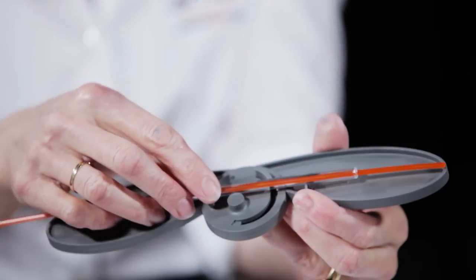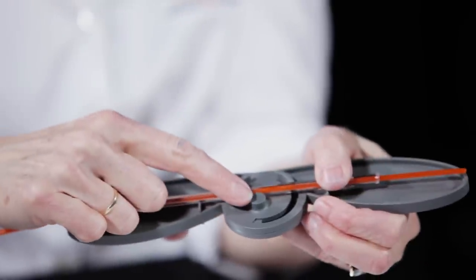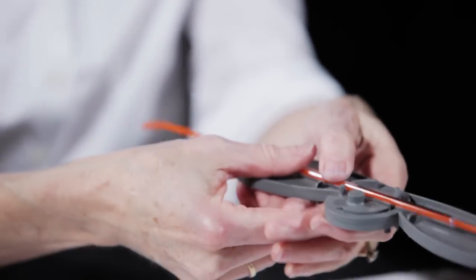To bend the OrphiTube, insert the orange nylon rod. Place in the OrphiTube bending tool aligning with the notches. The tube will bend at the level of the large circle in the middle of the tool.